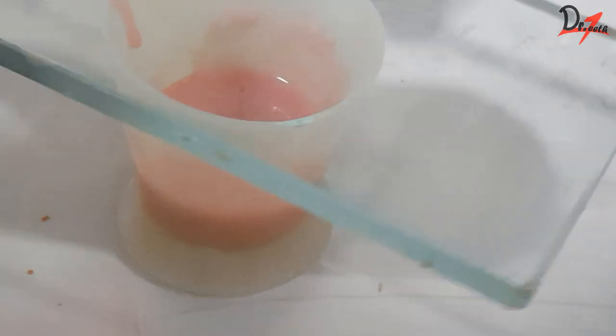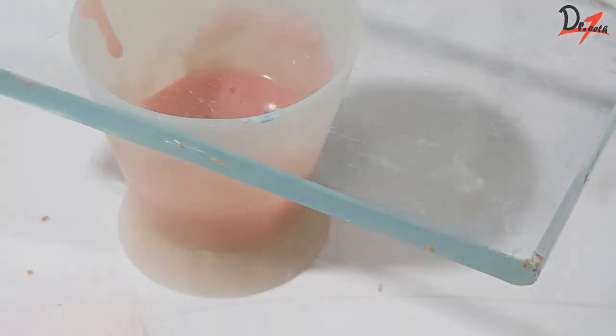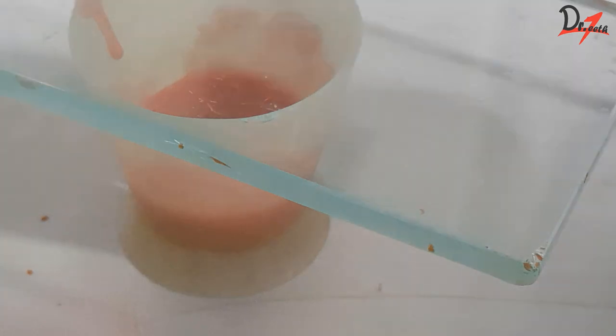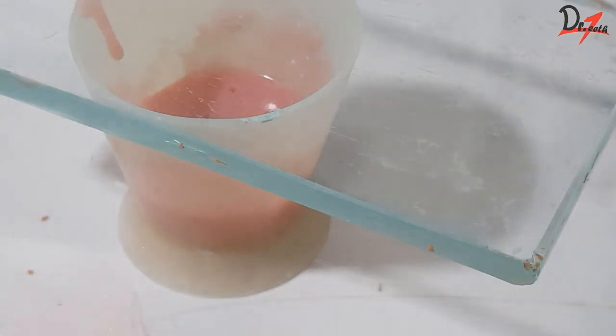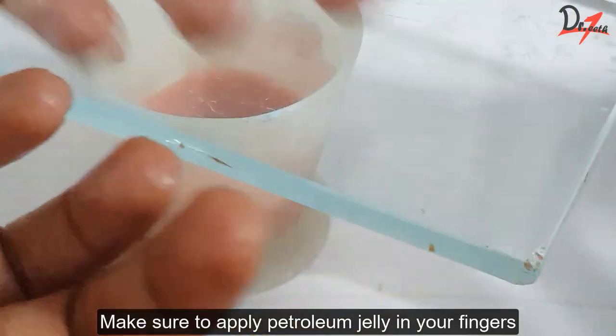Make sure that you cover the container so that the monomer doesn't evaporate. If the monomer evaporates, you will get porosity in your custom tray. You know those blotchy opaque surfaces we sometimes see? That is the granular porosity. So make sure you always cover it.